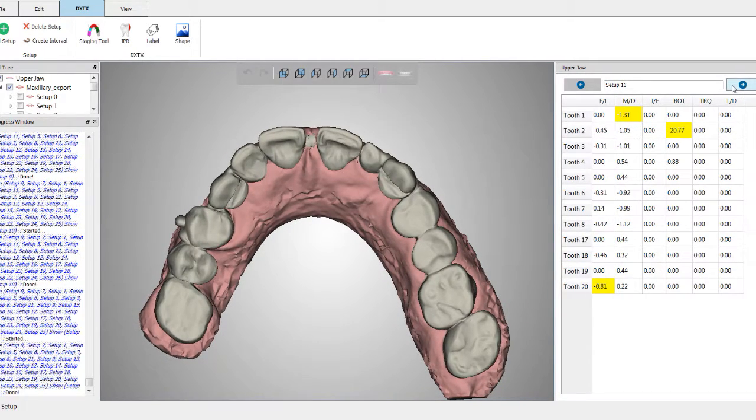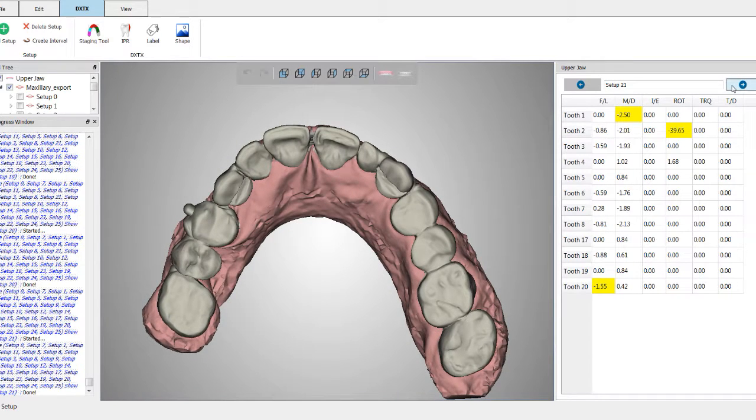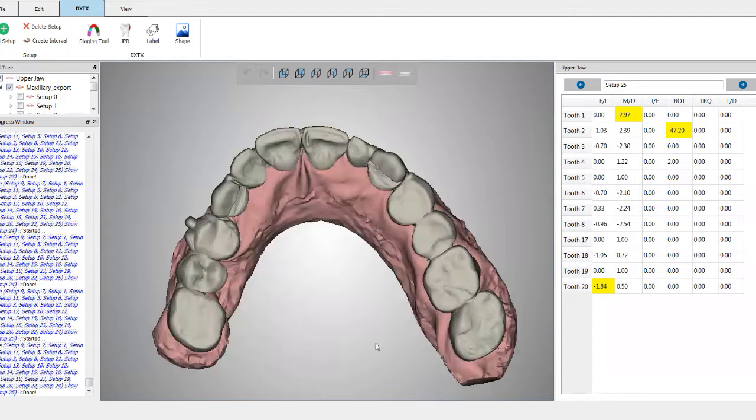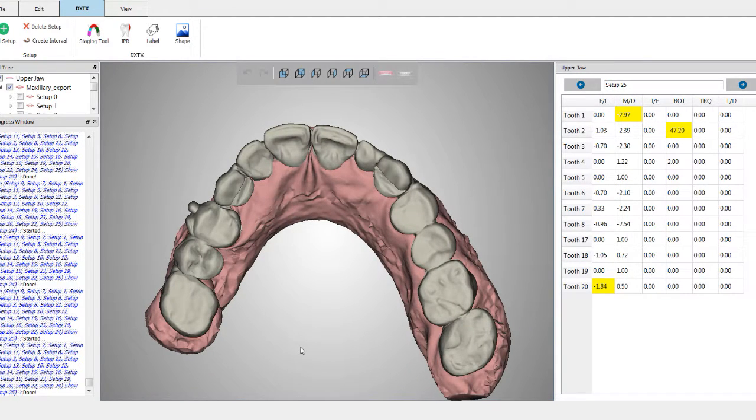Again, on a case like this, I would probably be considering rescanning and doing the refinement at around, I would say, 20 or so. But I just let the clinical conditions dictate when that happens. And that's what's nice about the flexibility with Orchestrate, is that you can really adjust things on the fly for the patient. But in a case like this, I think I'd probably be expecting a rescan anywhere between 15 and 20. And at that point, I think I could probably finish this case with one more scan.